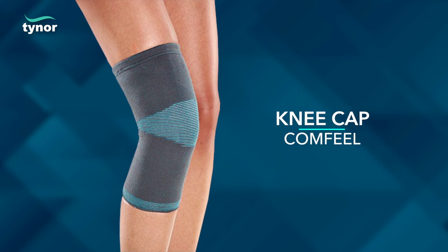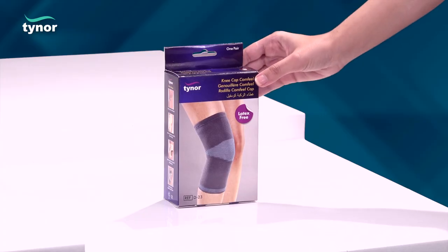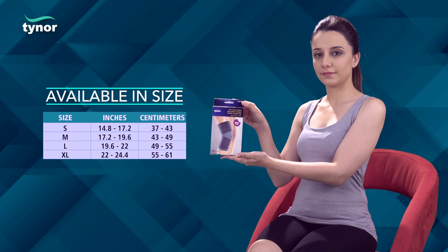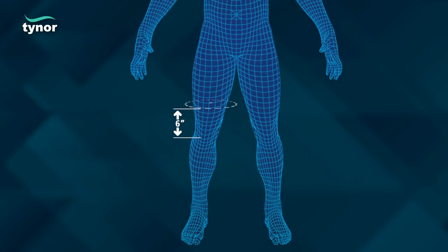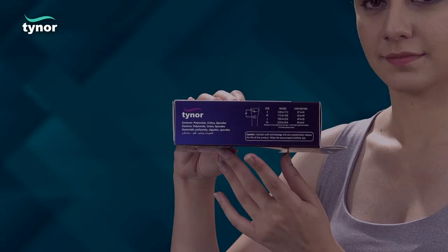Here, we will discuss how to measure the size and how to use the Kneecap Comfuel. Kneecap Comfuel is available in four sizes. Measure circumference around mid-thigh, approximately 6 inches above the knee. Then refer to the chart printed on the box of the product.